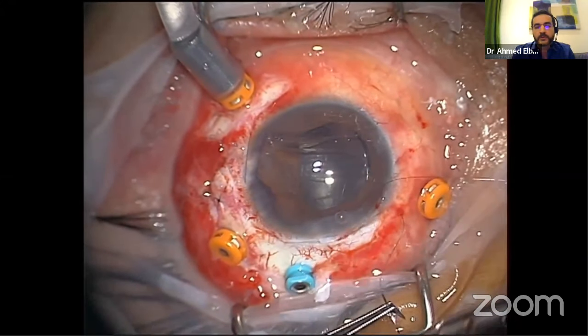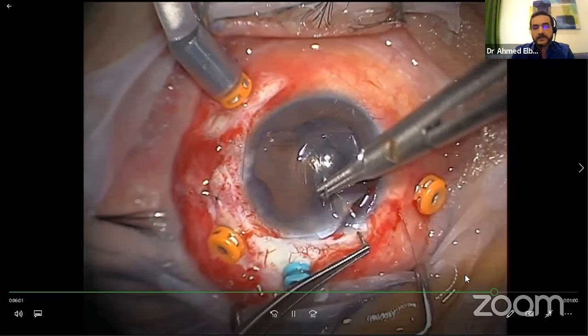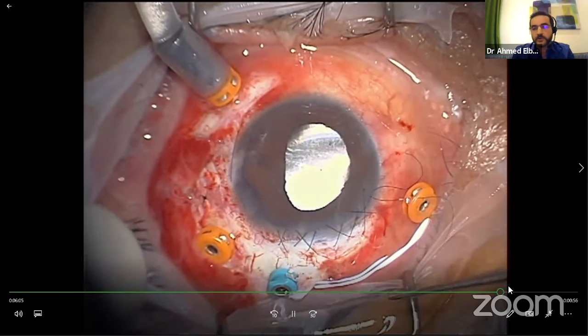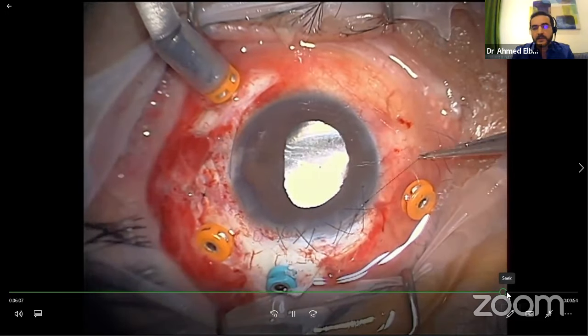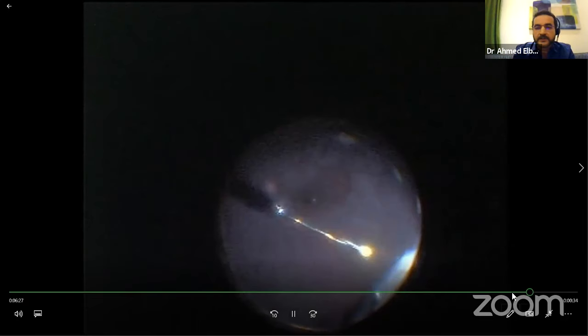We suture the cornea, and you have to be a little bit fast in this step because you don't want hypotony for too much time. And after that, you will go back to complete our surgery, remove the perfluorocarbon, and do peripheral vitrectomy, and for sure we do endolaser around the trimming of the retinal tear superiorly. As you can see here, it's very peripheral, you need to indent. And I was lucky because the tear was superior.